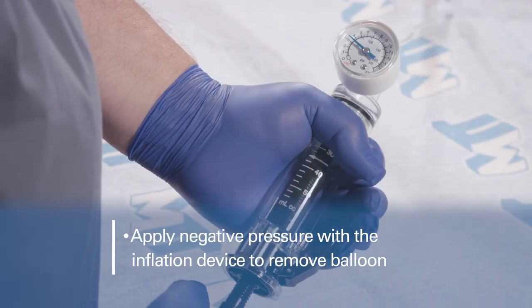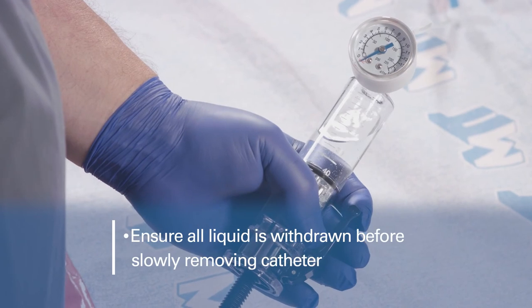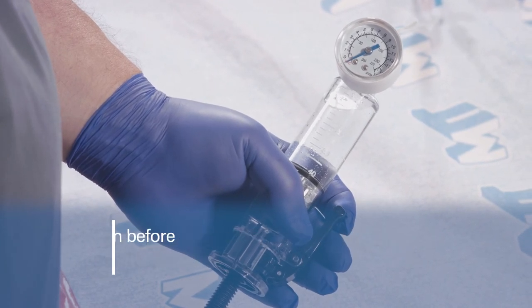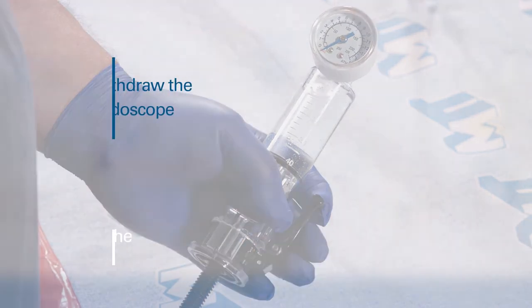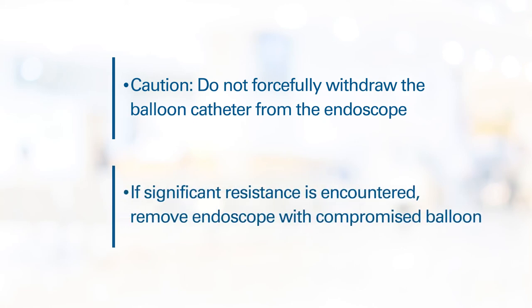To remove the balloon, apply a negative pressure using the inflation device. Ensure that all liquid is withdrawn from the balloon before slowly removing the catheter from the endoscope. Depending upon the balloon size and chosen medium, this can take 10 to 30 seconds. Before removal of the balloon catheter, reduce resistance by straightening the endoscope where possible. Do not forcefully withdraw the balloon catheter from the endoscope. If significant resistance is encountered, removal of the endoscope along with the deflated balloon may be required to prevent damage to the endoscope.